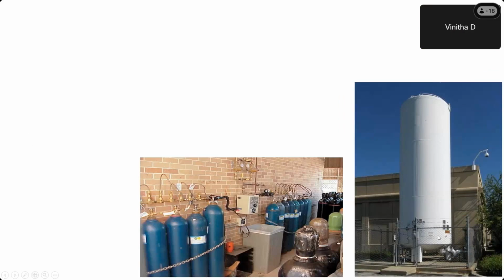Okay. Sometimes they may ask you, what are all the criteria that should be fulfilled to install a liquid oxygen plant in your hospital? Tomorrow you become a consultant and you go to a new medical college and they immediately give you an assistant professor job. And they ask you, we want to install a liquid oxygen plant. What are all the criteria or guidelines to install this? From this picture, what are all the things you can see? Is it in the open or is it inside any shed?